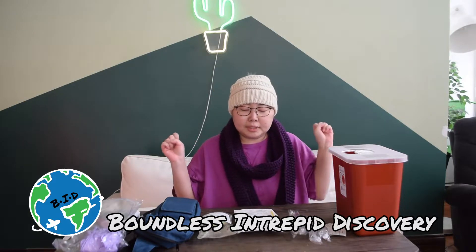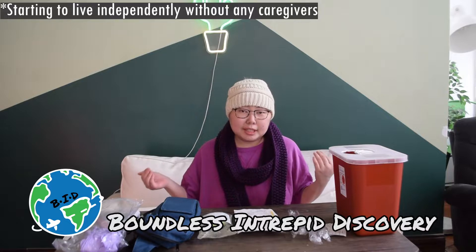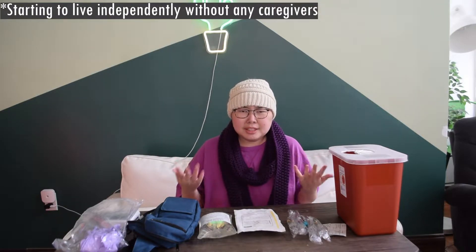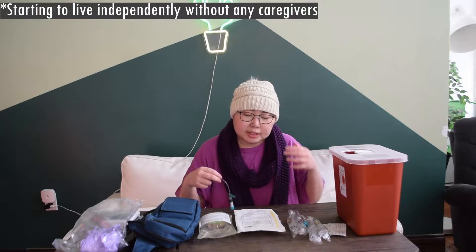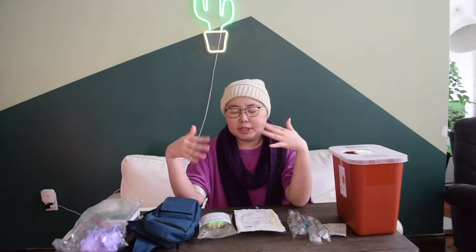Hey everybody! I'm starting off on my own right now. For the last few days I've been giving myself my own magnesium infusions, which is really empowering. It looks a little scary, which is why I wanted to share it with you. If you haven't been watching the other videos — I had a bone marrow transplant, I have a bunch of autoimmune disorders. It's a long journey, but I'm at home now and I have to get daily magnesium infusions because I'm on cyclosporine, which lowers your magnesium. So every day, this is what I do.